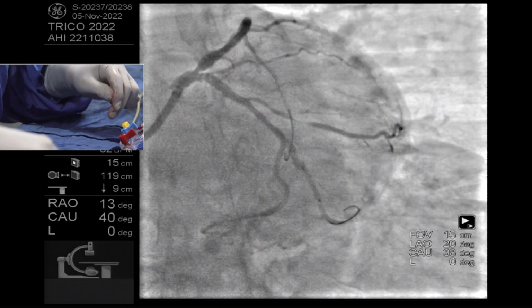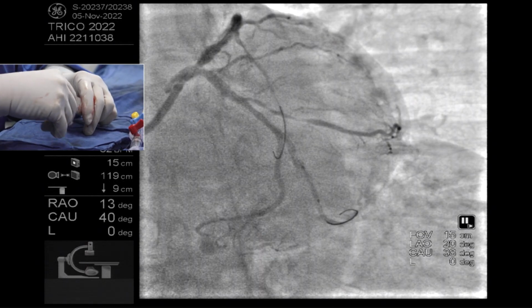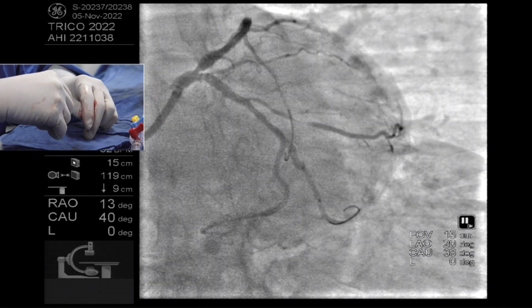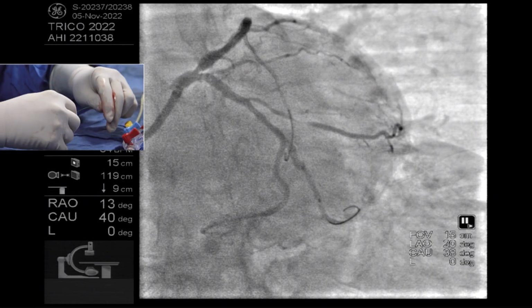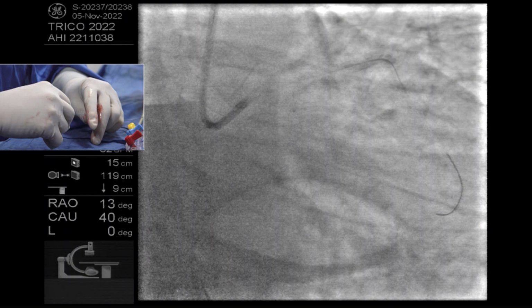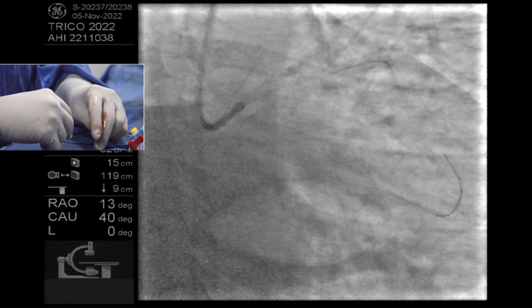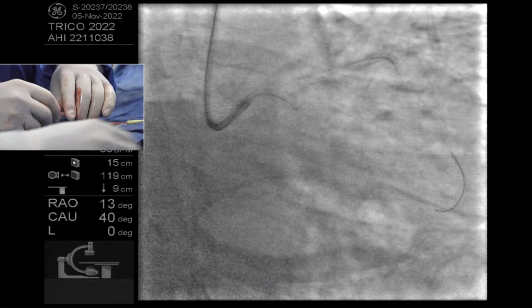In this case, I don't think it will work much, but it could be tried if there is nothing else left. Your point was a great one earlier on. It's maybe not the entering, but a few millimeters in where we're losing that option. It's where the wire prolapses, and the balloon can support that. I think it works probably mostly by straightening out the proximal.